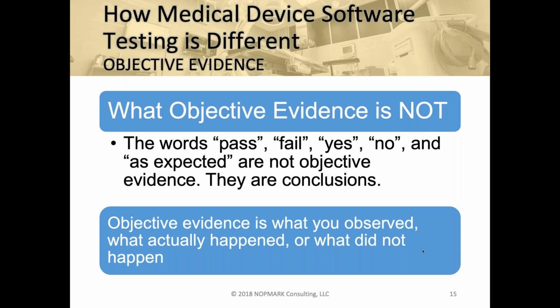Depending on what company you're with today or what industry you're in, you may have test cases or test plans that are run, whether they're manual or automated, that someone would execute, or an automated system would execute, and you just get a pass or fail. Oh, did it meet expected result? Yes or no? Those things do not meet the criteria of objective evidence.